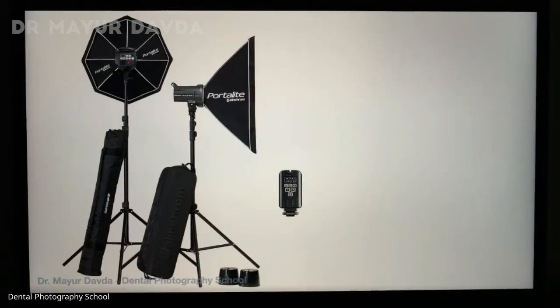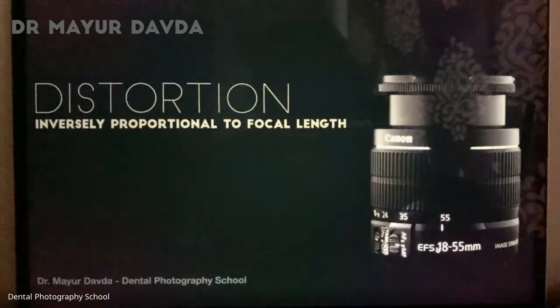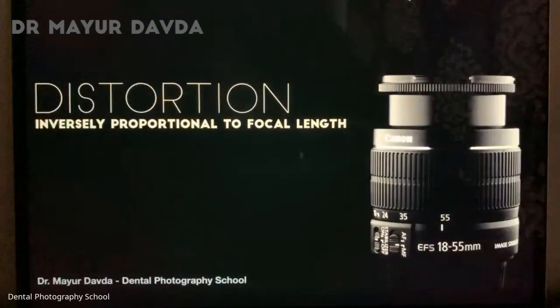So that completes about the flash, and now we speak about lenses. Typically you get this lens for free whenever you buy any beginner level camera. It's called the 18-55 lens. So the question is, can you use this lens for dental photography and documentation? The answer to that is no.